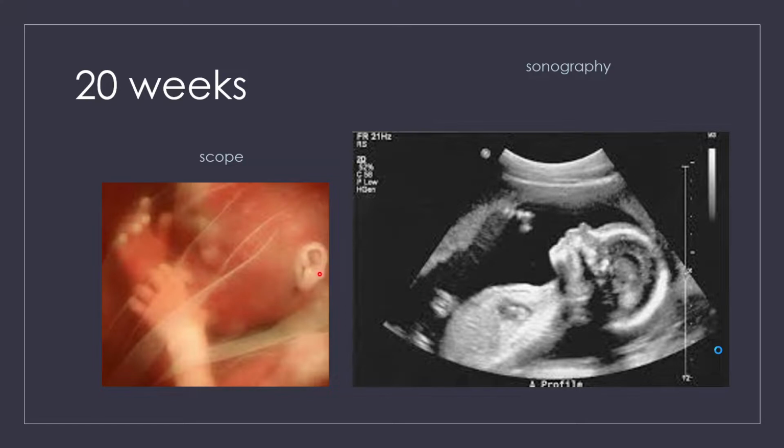Look at that little ear, how developed it is. Here at 20 weeks, now this one is a little bit bright. We might want to turn the gain down, but it gives us a really good facial profile. This is the heart. There's the spine. That's a piece of a hand coming in there. This is umbilical cord.